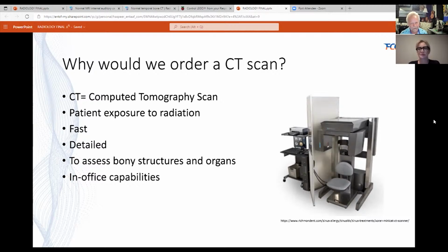is quite a value, both in that it's small, it could really fit in just an exam room and doesn't take a whole lot of high-powered energy. You just plug it into the wall. There are some certifications that are required in inspections for radiation compliance, but all in all, it's almost a plug-and-play device that we've been using continuously.